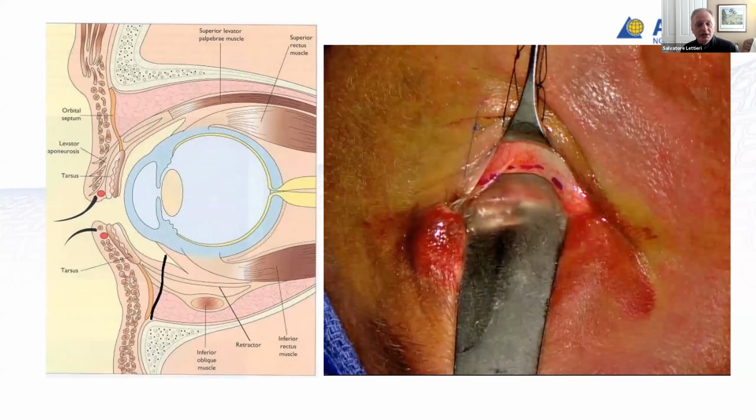You can connect this with a lateral canthotomy to be able to get a little bit more exposure. But for today, for these purposes, I'm just going to concentrate on showing you the fornix incision for an orbital floor fracture. Once you get comfortable with this, you can then extend your treatment, but just get comfortable with it.